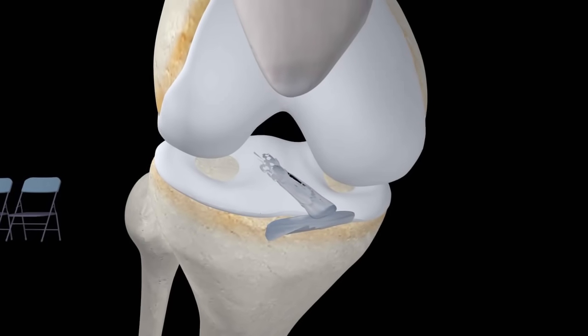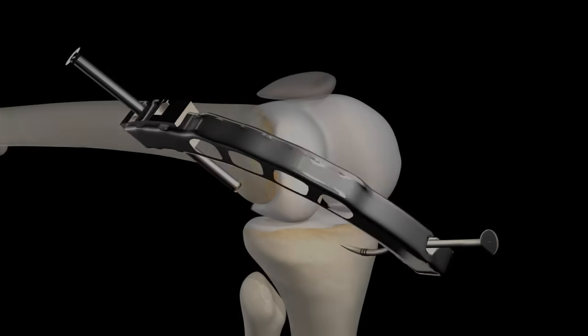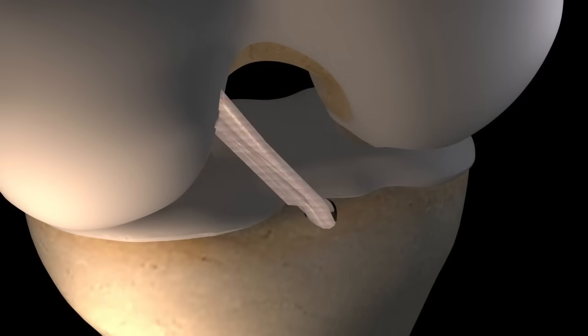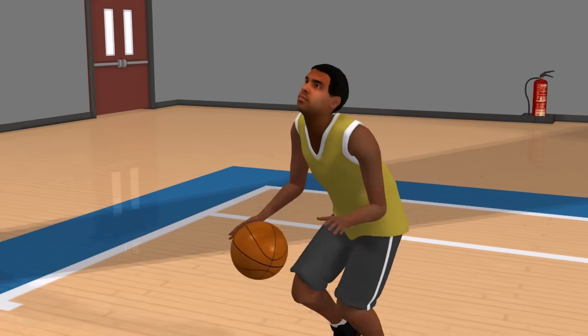The ACL reconstruction operation is now typically a one-hour outpatient procedure, performed successfully more than one way. We'll examine one of the more common methods used in ACL reconstruction.